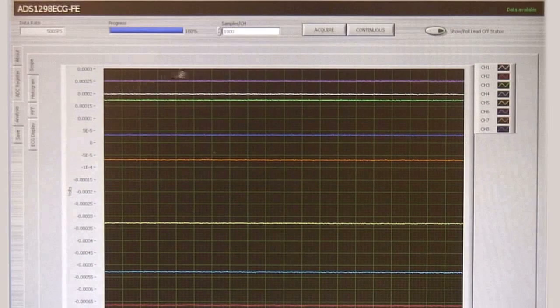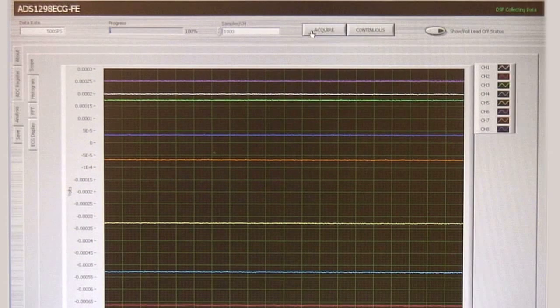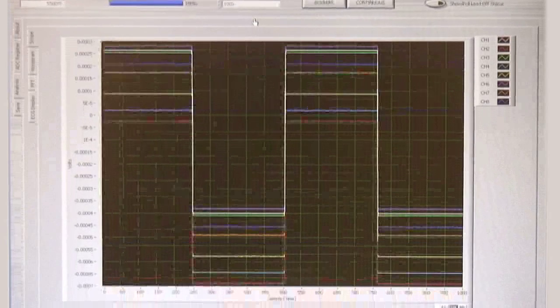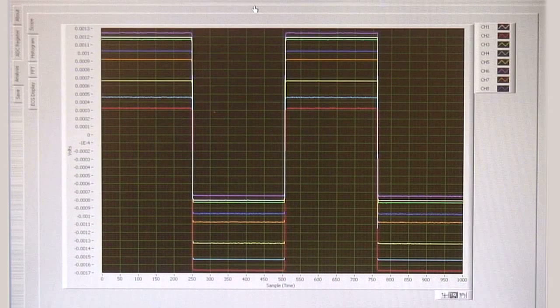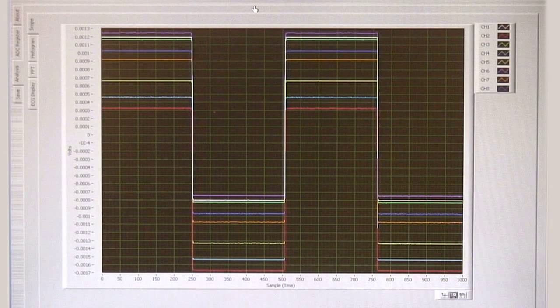Now when I press acquire again, a square wave of several millivolts will let me know that the PDK is communicating correctly with the computer.